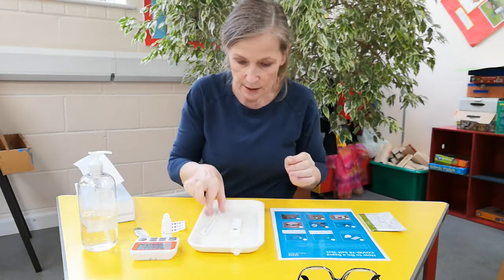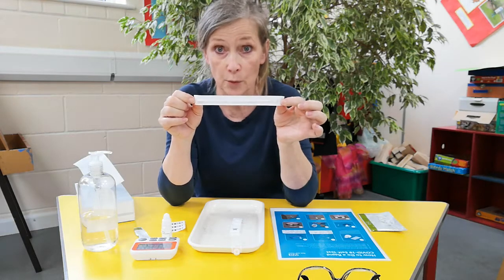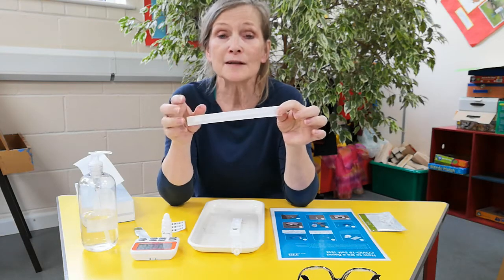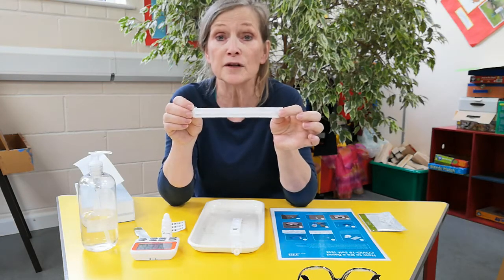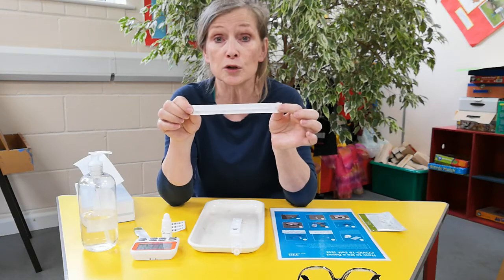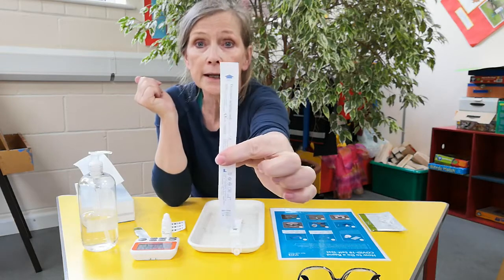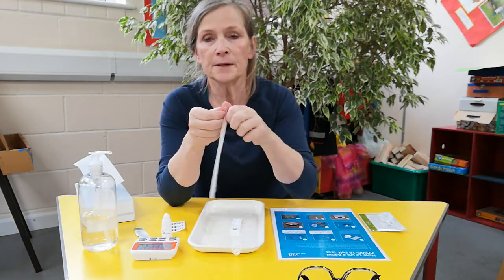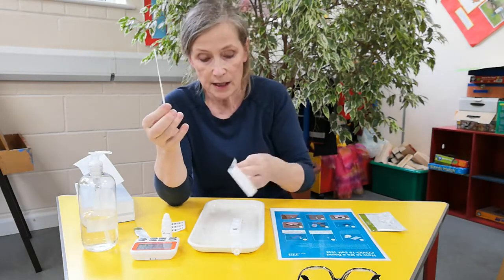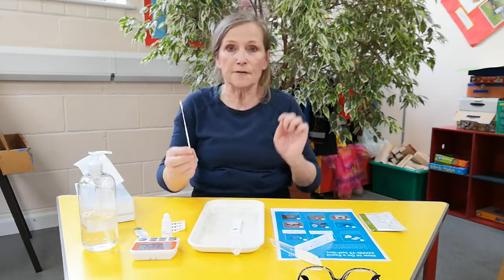Now you're going to get out the swab. The best analogy I can think of is a bottle brush, and what we're going to do is bottle brush up our nose. You can do your throat and tonsils at the back of your throat, but that's very difficult to do for yourself — you end up doing a whole mouth swab, which is what we don't want. It is perfectly acceptable to just do both nostrils with one swab. To open it up, it states quite clearly 'open', so peel it open about a third or halfway down and then pull it straight out. You'll see what I mean about the bottle brush.